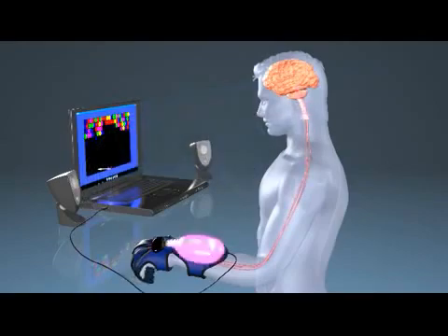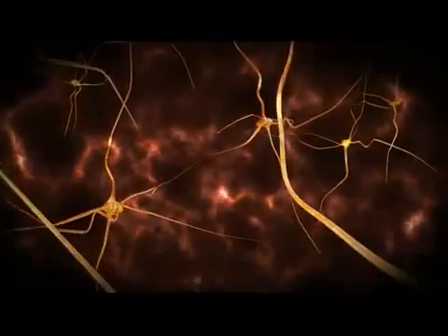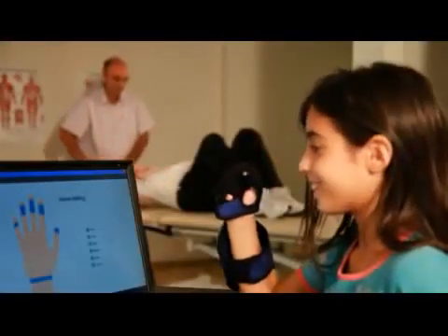The motion information provides a continuous stream of feedback on range, speed, and quality of hand movements. This real-time audio and visual feedback teaches the patient how to move their hands again, which enables them to better perform functional tasks.